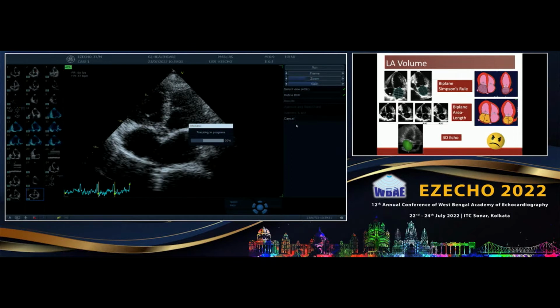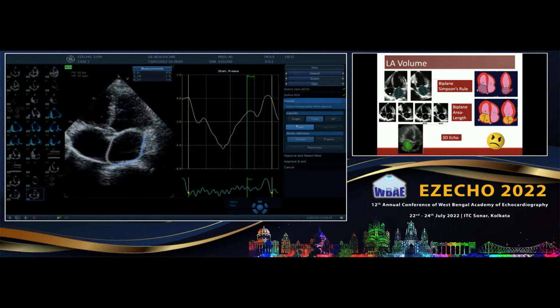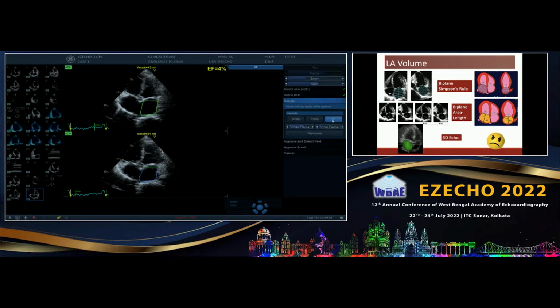The funnel of the mitral valve. Yeah, perfect. So always you should be perfectly horizontal at the annulus. Don't enter into the triangular funnel of the mitral valve in the LA volume, correct? So that is the perfect LA volume. And this is how we got it.